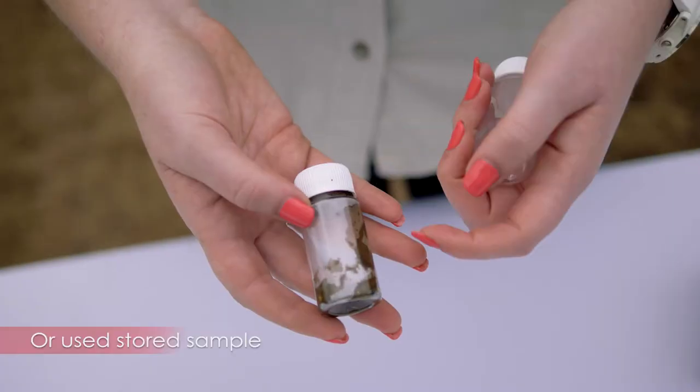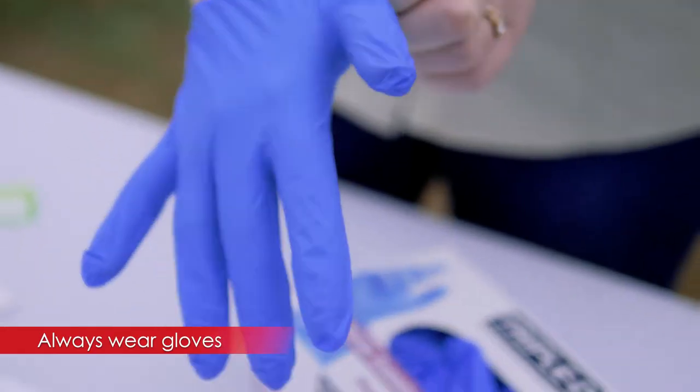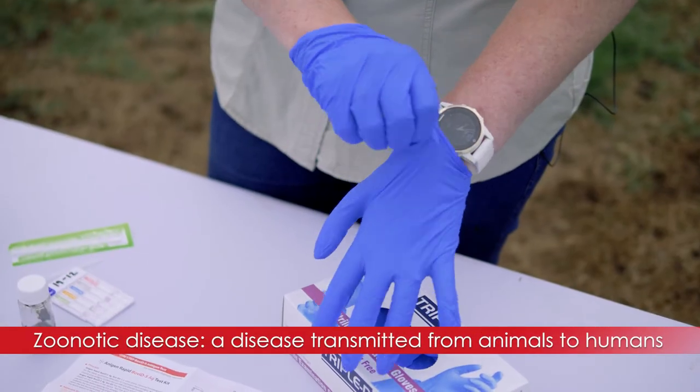You have two ways to use it: either when you're on the farm you can collect directly from the animal, or if you can't test immediately, you can collect the samples, take them back home, and put them in the fridge. It's important to wear gloves, as there are zoonotic diseases.